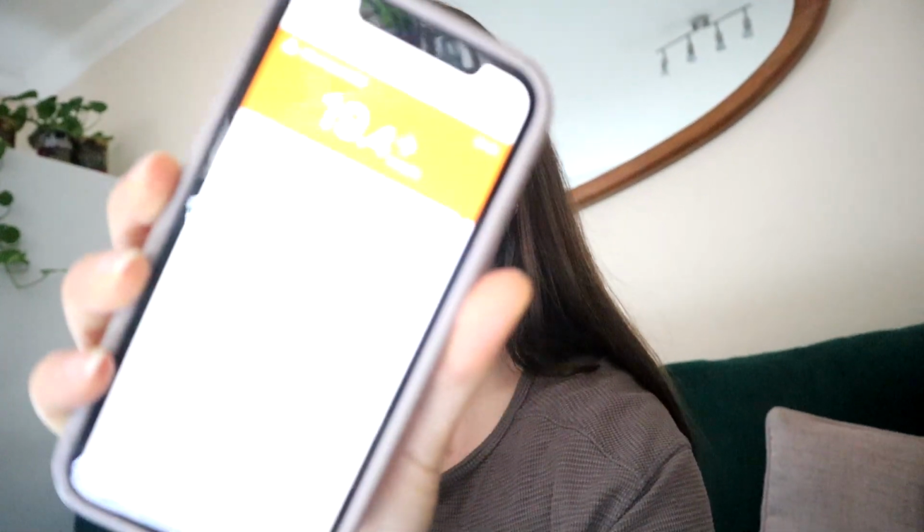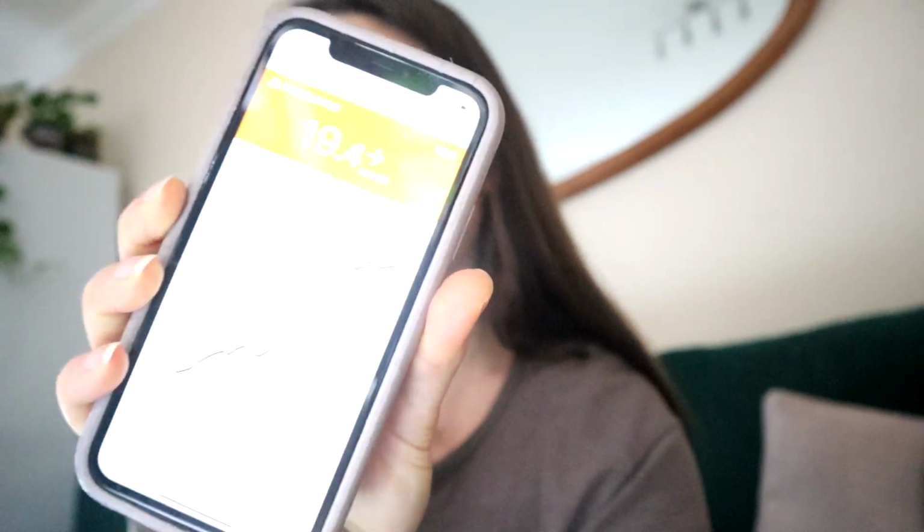Oh my god, okay, I've done another scan and it's gone up to 19.4, so that has to be the site. So we're gonna put in a correction. I'm also gonna put on a temporary basal of 120%, just doing it now, over the next 3 hours to help flush out the ketones that I will now have. It's just so annoying today, I'm so busy and I want to do a sleep. And then we'll do a bolus and see what it wants us to do.